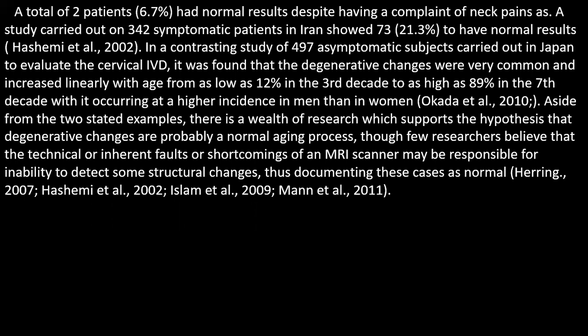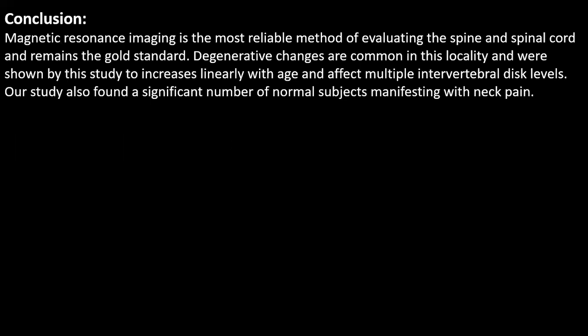and increased linearly with age, from as low as 12% in the third decade to as high as 89%. Aside from the two stated examples, there is a wealth of research which supports the hypothesis that degenerative changes are probably part of the normal aging process. Though few, the MRI scanner may be responsible for the inability to detect some structural changes, thus documenting these cases as normal.